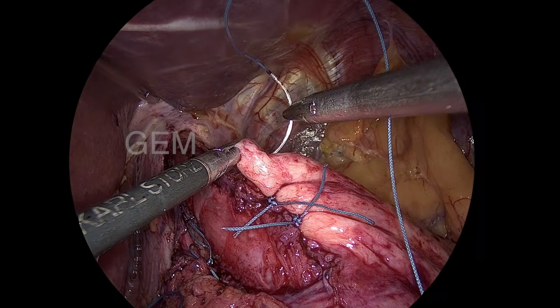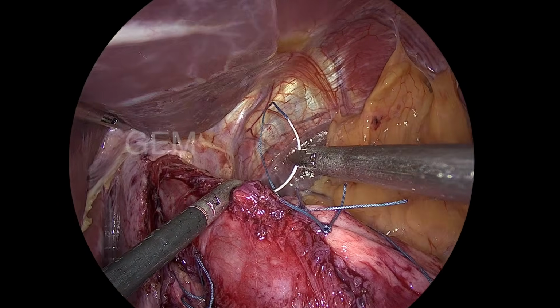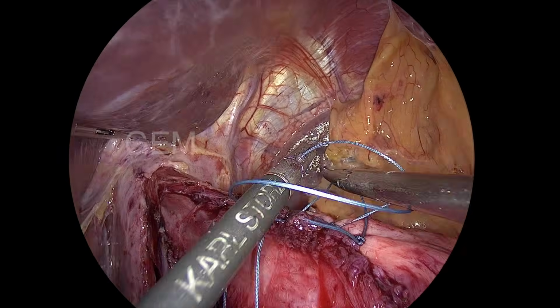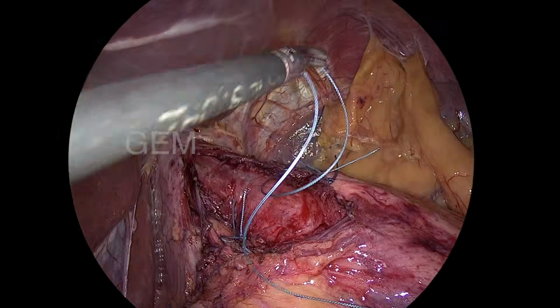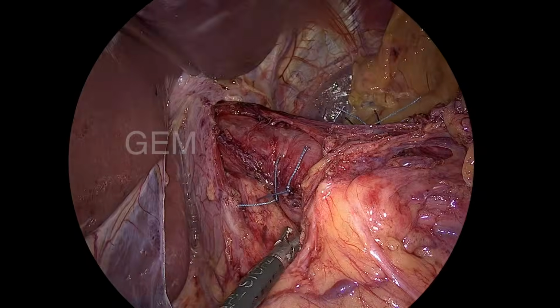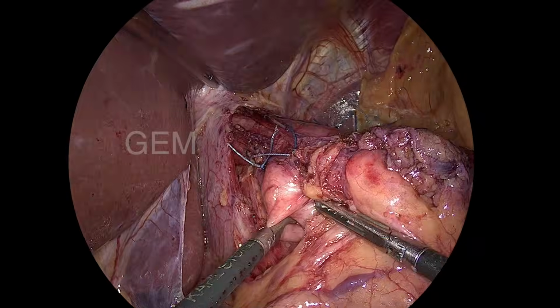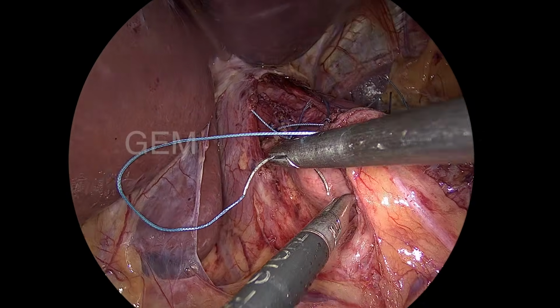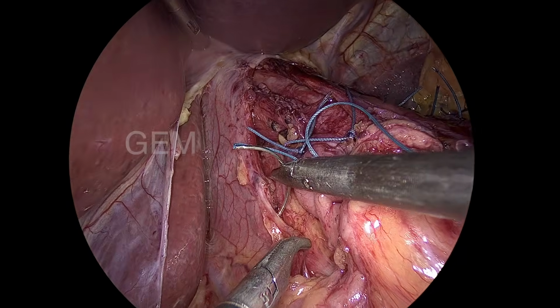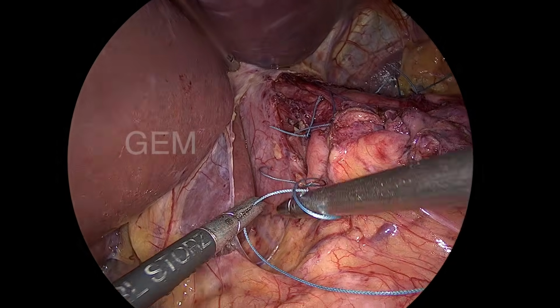Everyone's fear is injury, mucosal injury of the esophagus or stomach. That is why I am explaining step by step how to do myotomy without any injury. I am going to publish another 7-8 videos. Totally 10 fundoplication videos will definitely be helpful for you to learn this technique, and anyone can do this technique, so that achalasia cardia is treated laparoscopically. Hellers cardiomyotomy with Toupet fundoplication is the gold standard for achalasia cardia.